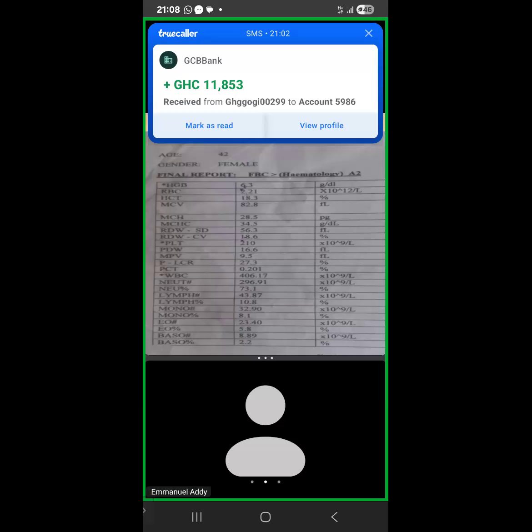Okay, now there's no histogram there. We have full blood count results. Your full blood count machines, do they give you histograms? If they give you histograms, fine.